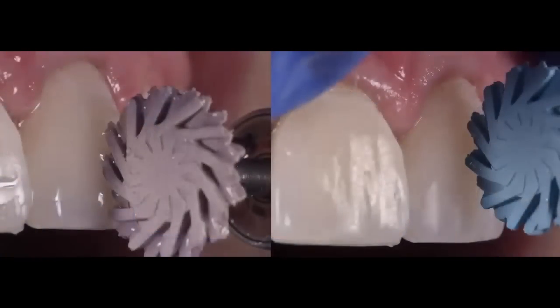Now we start polishing, and this is the Shape Guard system developed by Cosmedent. What I like about Shape Guard is that you first use the lighter wheel, and then you go to the darker wheel, so it's pink and blue. And what you do is, I always recommend using a little bit of water, and this is my final polishing sequence.